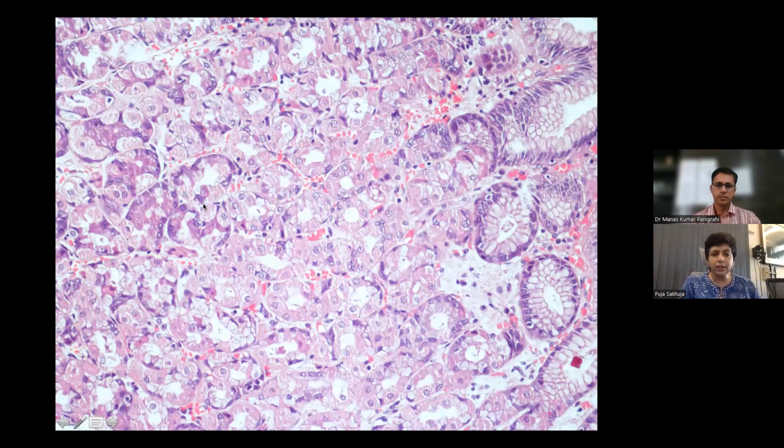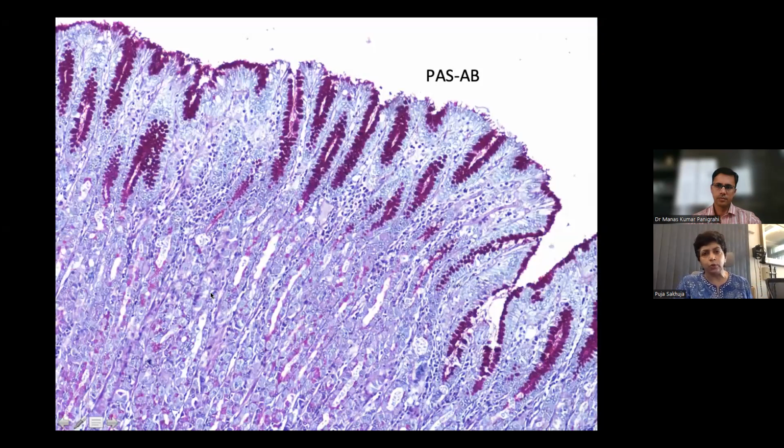The endocrine cells are also present, haphazardly scattered here, and they usually have, if you see over here, this sort of slightly triangular appearance with a dense eosinophilic cytoplasm. Of course, now with so much immunohistochemistry, if I need to identify these, I can use immunohistochemical tools.